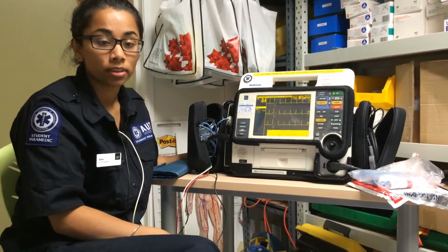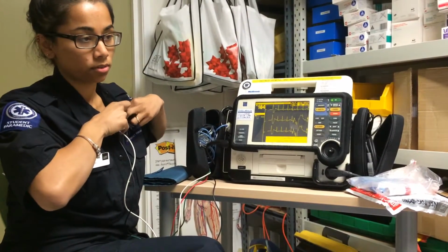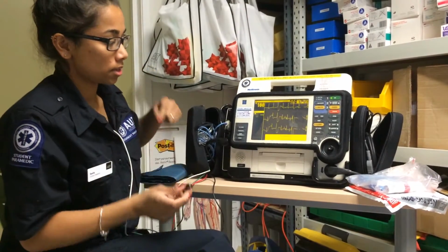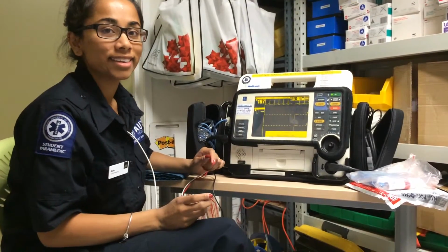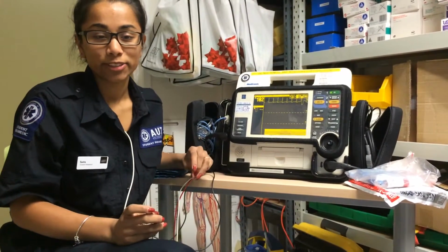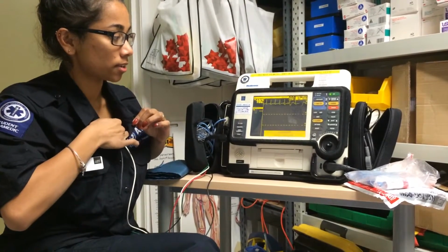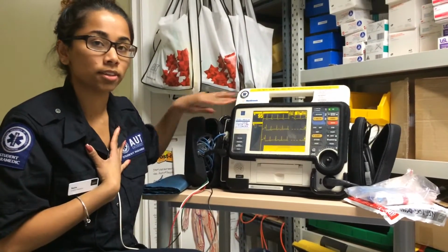And also while viewing the live feed, if a lead was to come off, you would get a display on the monitor like so. So it'll be a dashed line, and this doesn't mean that it is asystole. So you would then just simply place the lead back onto your patient, and the monitor will be restored with their vital signs.